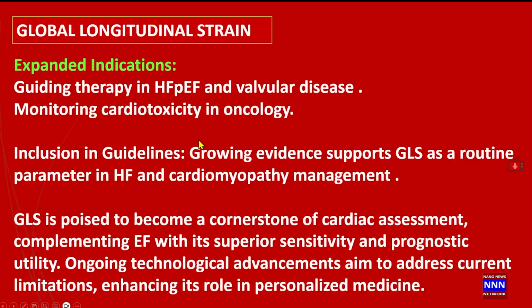All right, what are the expanded indications? Guiding therapy in patients with heart failure with preserved ejection fraction and valvular heart disease. It helps us to monitor cardiotoxicity in oncology patients. You do a resting study and you do a study 3 months later, and if you see some changes, maybe that's the time to consider or reconsider the chemotherapy regimen.